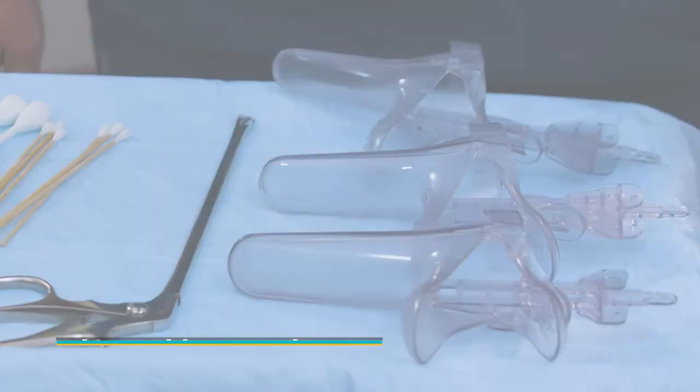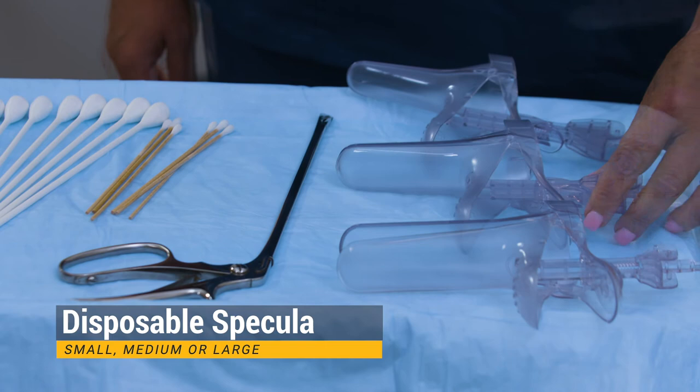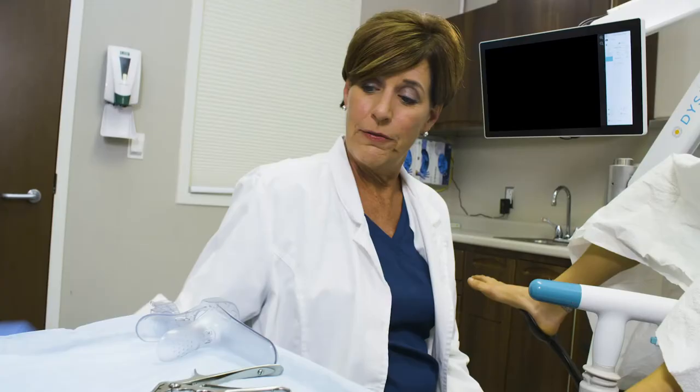Dysys has three sizes of proprietary disposable specula: small, medium, and large. Ensure there are a variety of sizes available for the provider. Dysys Ultra is now ready for the examination.